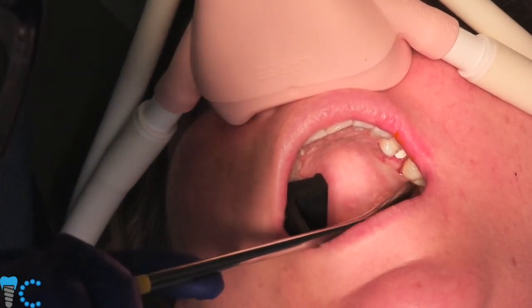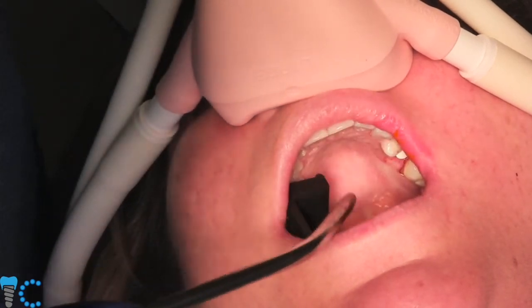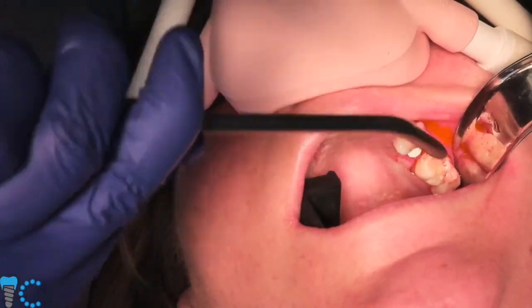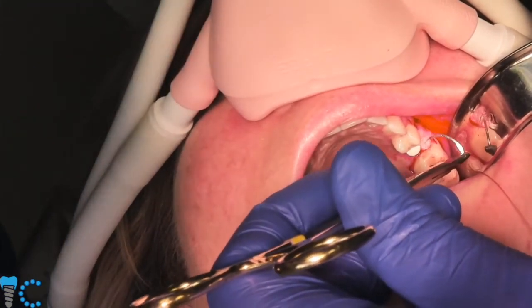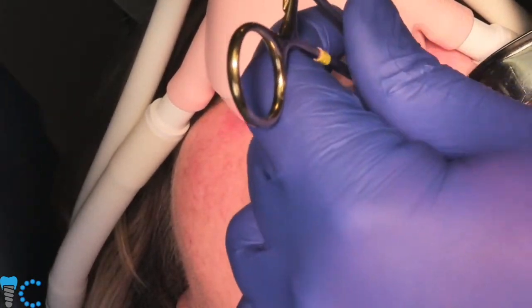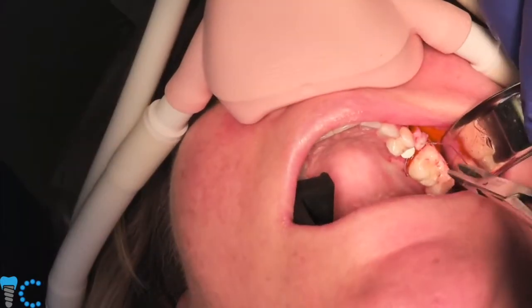So maxilla or mandible, 3 months. If we do an immediate extraction implant placement, we have them back in 3 months to restore the implant. So regardless of whether it's the immediate case or not, whether it's maxilla or mandible, 3 months and we restore these, based on how long it takes them to integrate to get that secondary stability that we're really looking for.